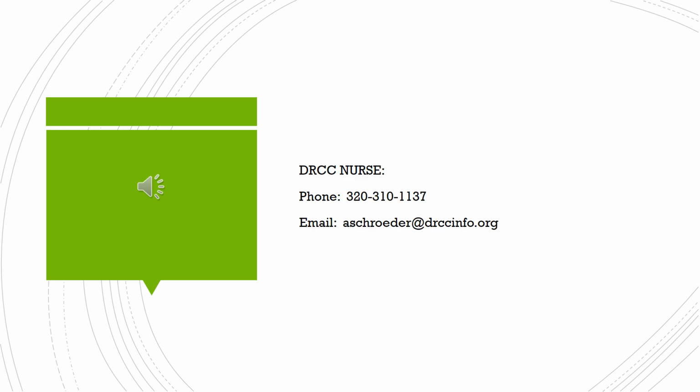If you've exhausted all options for removing a plug in the G-tube, contact the DRCC nurse as soon as possible via the phone number and email address listed. If the DRCC nurse is not available, the client may need to be taken to the emergency room for tube replacement.